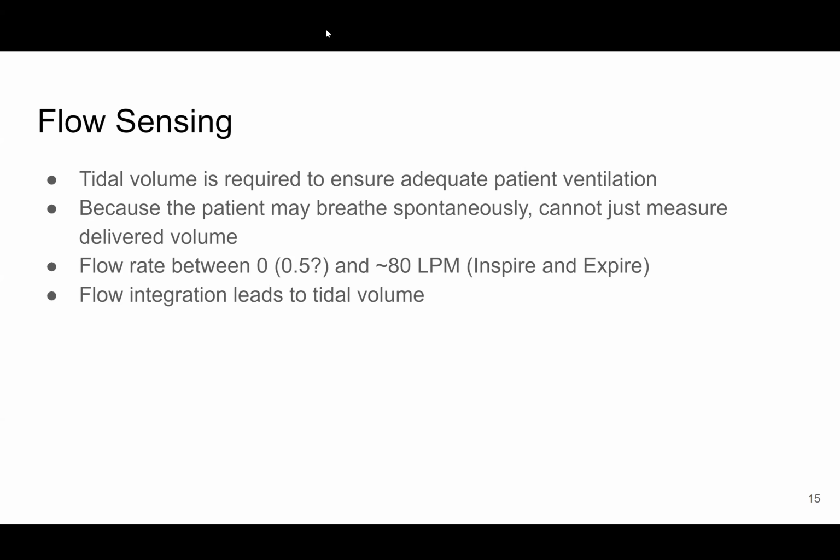And then, as Edwin was talking, the flow integration leads to tidal volume, and so we need to track numerical error and linearity of response as well if we're doing integration.